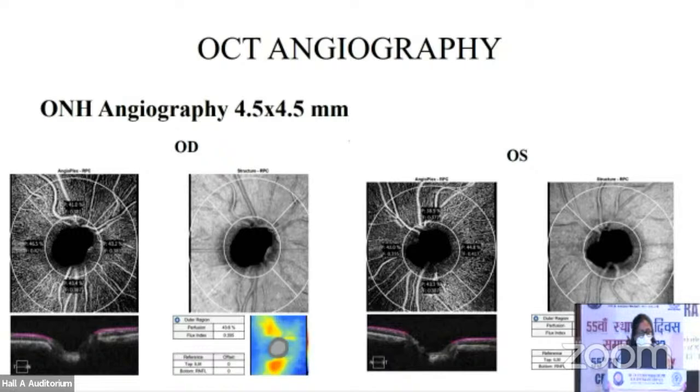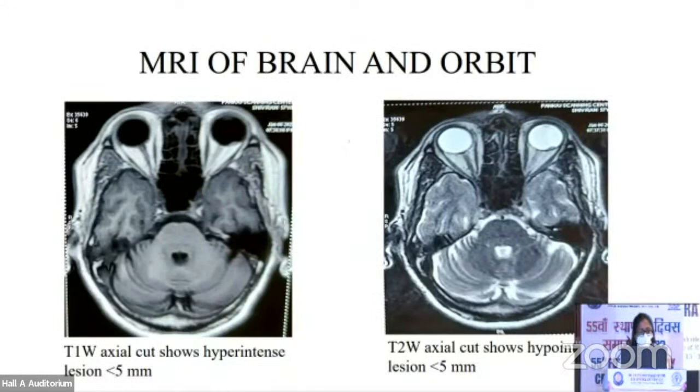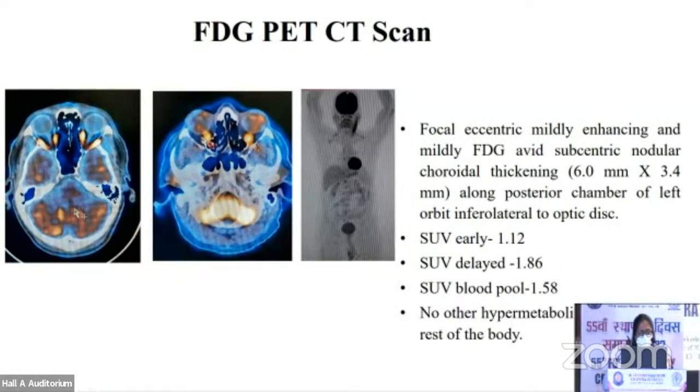The MRI image of the brain and orbit showed a hyperintense lesion in the T1 weighted image and a hypointense lesion on the T2 weighted image. Further, on FDG PET scan, there was a focal enhancing FDG uptake with no other metastasis in the rest of the body.